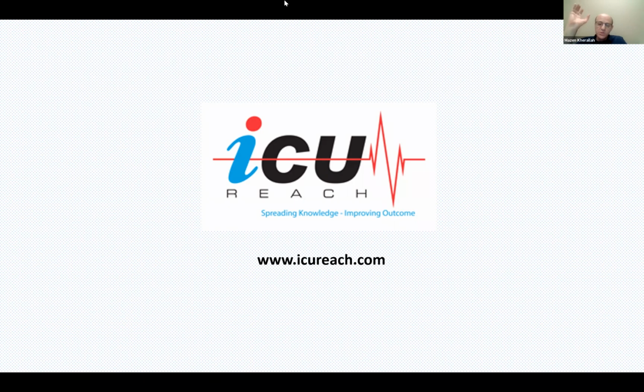Number one, you need the patient to be spontaneously breathing in order to assess the function of the diaphragm, and you can look at the diaphragmatic excursion, or the displacement of the diaphragm. If the value of that displacement is less than 1 centimeter, that means weakness of the respiratory muscles. And you can assess it in COPD patients. It's not different from COPD patients or other patients.